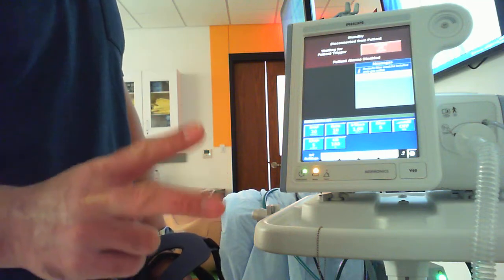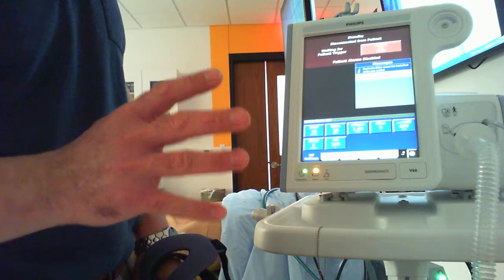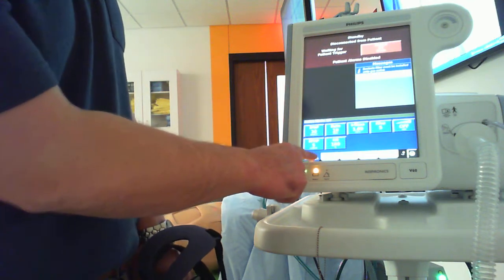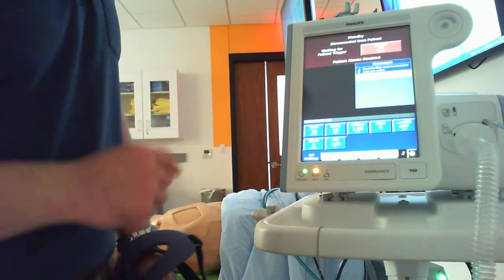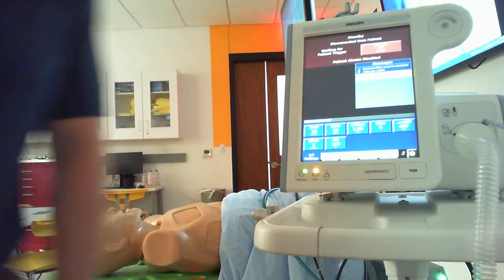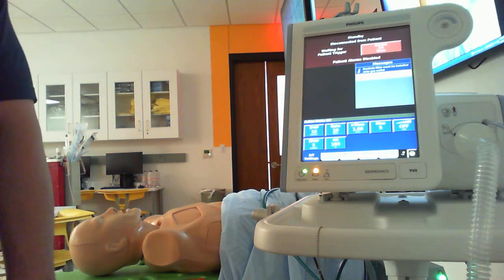The only 2 things we can really come up with and know concrete or have a better idea about for initial application will be your baseline pressure, and once again, it's blurry, I know, so our EPAP, all right, and our FiO2. We'd have to think about what's going on with this patient, and that would help us come up with an informed decision for those 2 selections, all right?